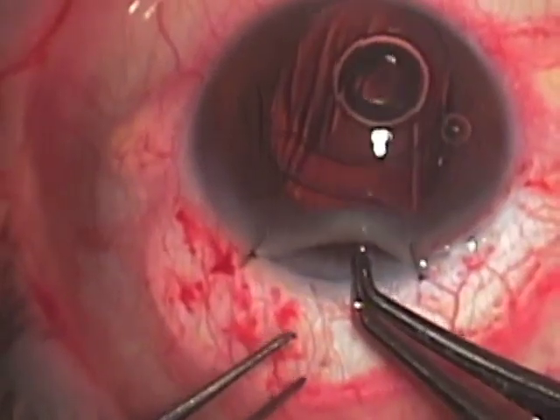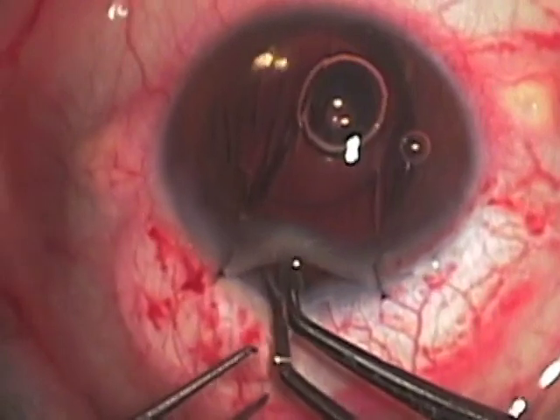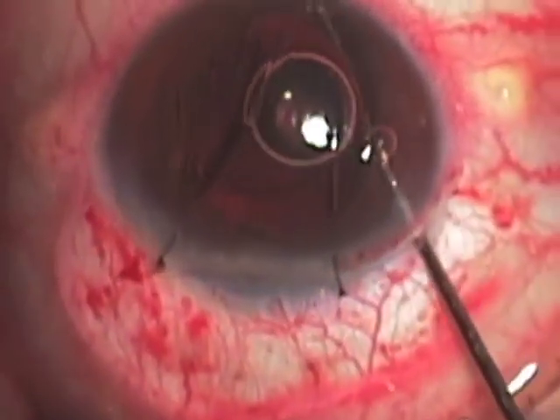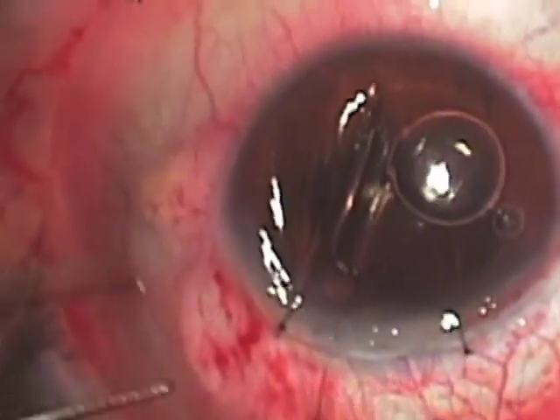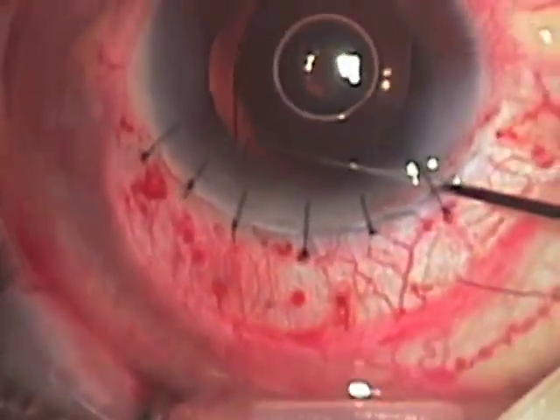With the glide out of place, we can then tuck the trailing haptic into the superior anterior chamber angle, and next we can use a Sinski hook or other instrument like a Kuglin hook to manipulate the lens to be sure that its foot plates are properly positioned in the angle.